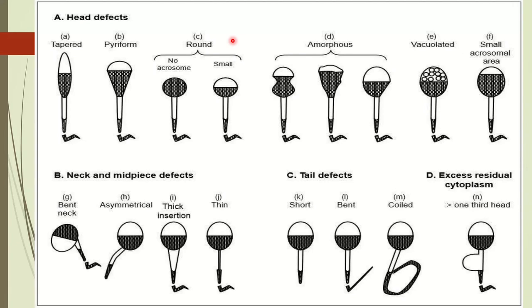But what you will have to understand is that for fertilization or pregnancy, it is not only sperm morphology; there are various factors. It might be the sperm count, sperm motility, or sperm vitality. All these things will also matter when we take into consideration the effectiveness or the chances of getting pregnant. So that's all about the abnormal sperms, their abnormalities in the head, tail, and the midpiece.